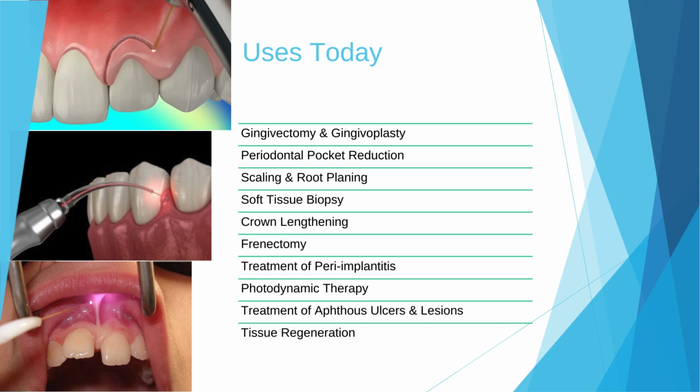Soft tissue biopsy. Lasers can be used to take biopsy samples or to remove soft tissue lesions. Laser's accuracy reduces the likelihood of damaging nearby healthy tissues.